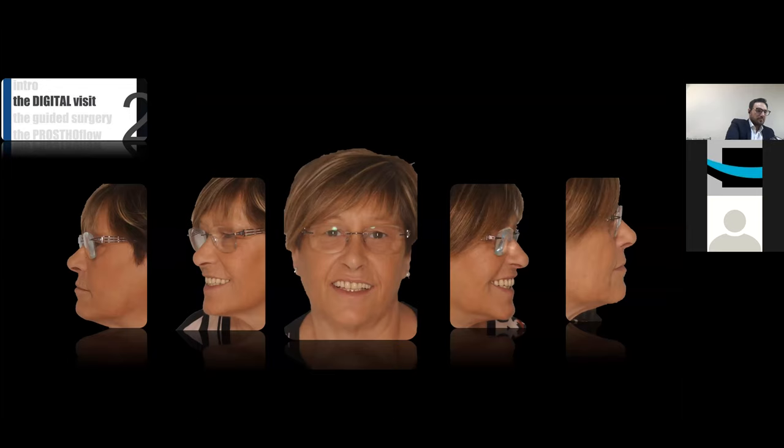The first thing that we do during our activity is to do the digital first visit. What is the first digital visit? I use some devices to collect data about function and about the aesthetic of the patient.